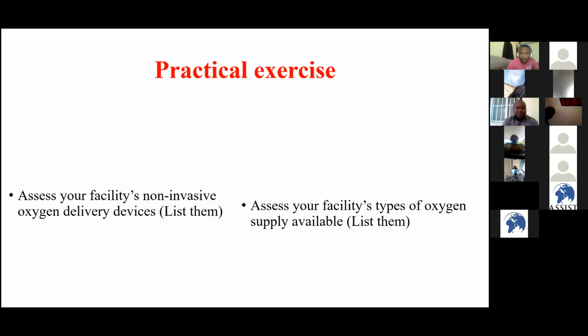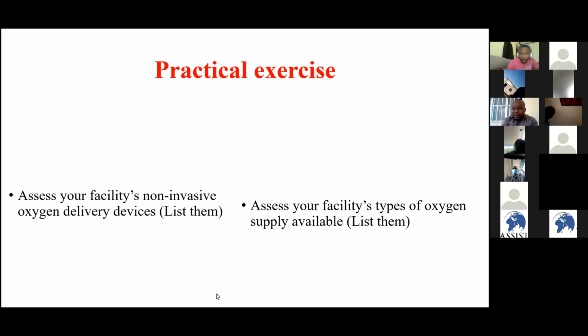Yeah, thank you for that answer. Just some addition. So I have a comment. Dr. Kanyamihigo, who asked this good question, I really want to emphasize. As we saw in the physiology of the non-rebreather mask or facial mask with reservoir, they have an oxygen gas valve and also exhalation valves. If you give fewer liters, that valve will stay closed because there is no pressure to help the patient inhale it.